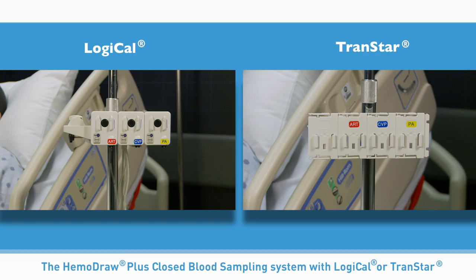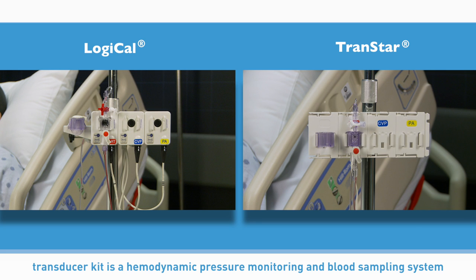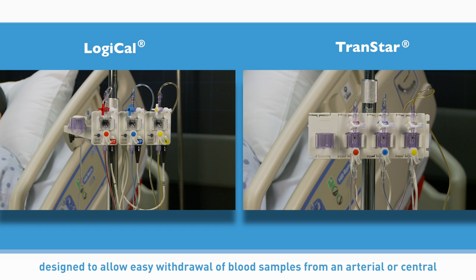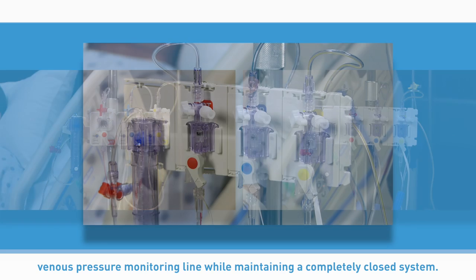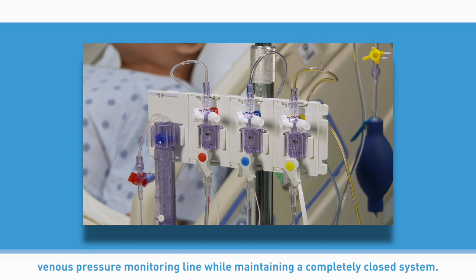The Hemodraw Plus closed blood sampling system with Logical or Transtar transducer kit is a hemodynamic pressure monitoring and blood sampling system designed to allow easy withdrawal of blood samples from an arterial or central venous pressure monitoring line while maintaining a completely closed system.